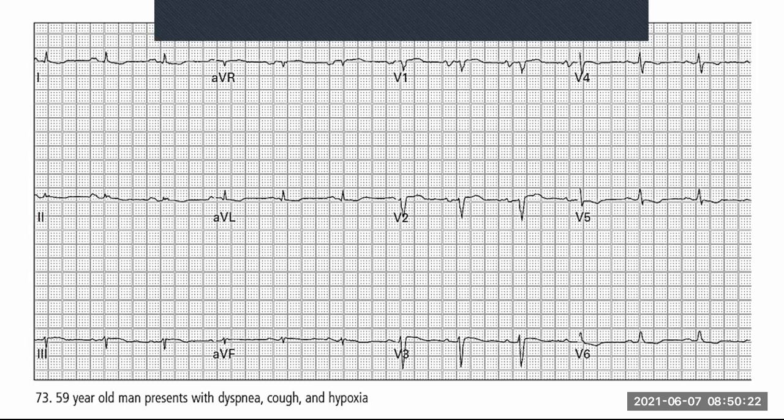Why is my patient's electricity not reaching the lead? Okay, so if you have a patient who's in anasarca, it's quite obvious, all right? But for example, a patient who's hypoxic, all right, or who's got emphysema, what are the two types that you get? Blue bloaters and pink puffers. I'm just talking about COPD.